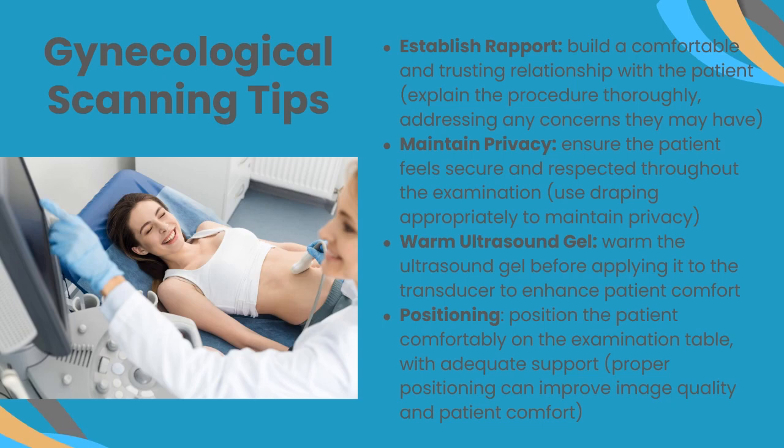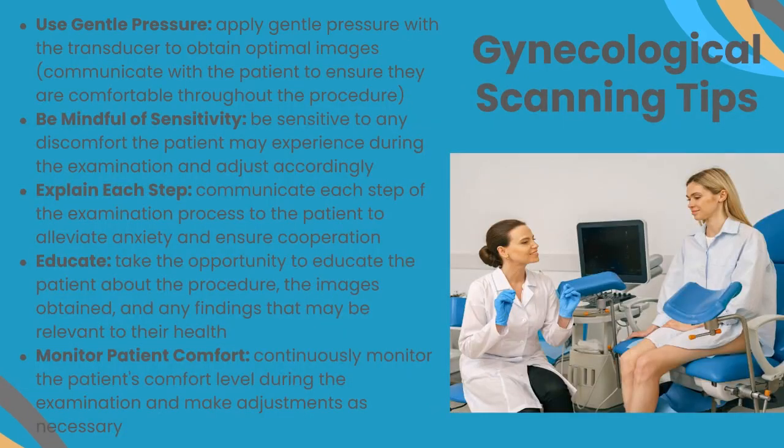Position the patient comfortably on the examination table with adequate support, and just make sure that your patient is comfortable. Explain things, answer questions. Making your patient as comfortable as possible is the most important part. Also, use gentle pressure with the transducer to obtain optimal images. Communicate with the patient to ensure they are comfortable throughout the procedure. Be sensitive to any discomfort the patient may experience during the examination and adjust accordingly.